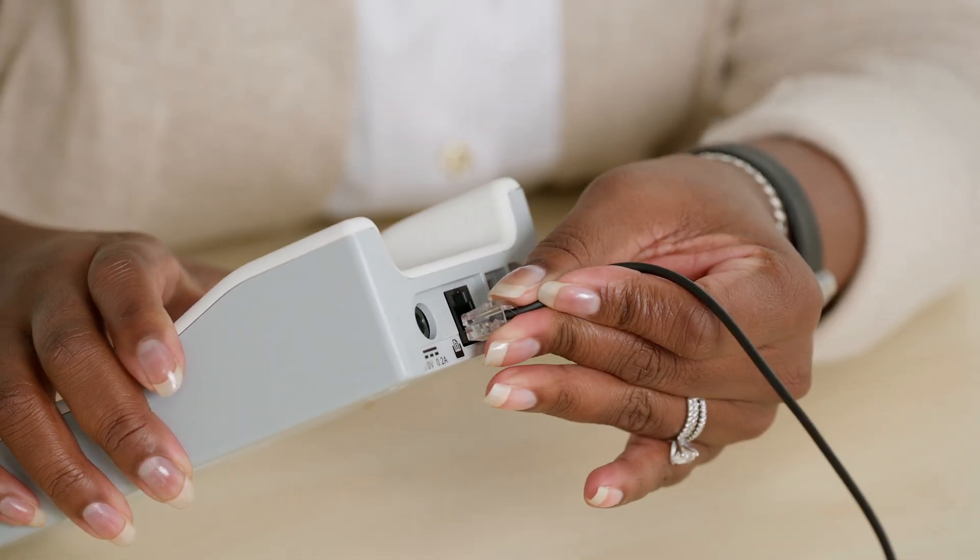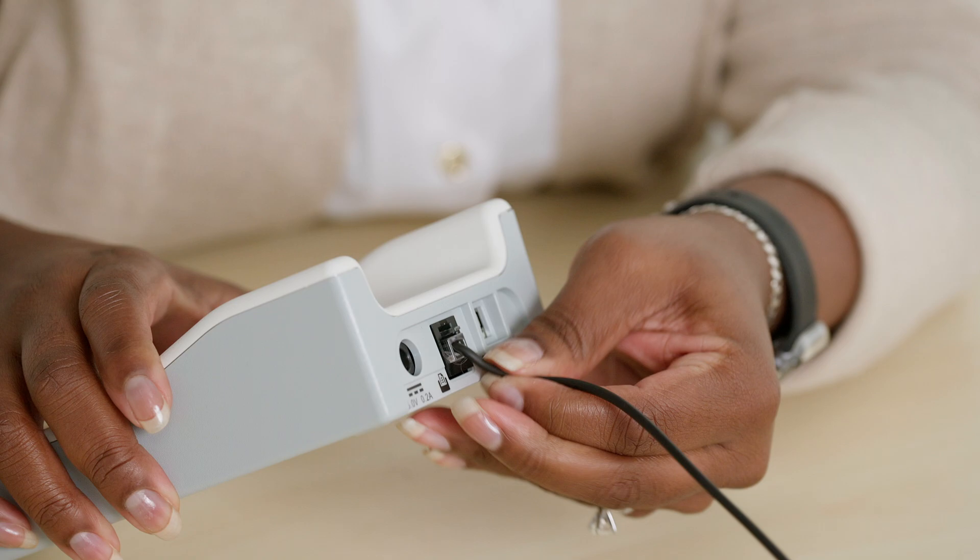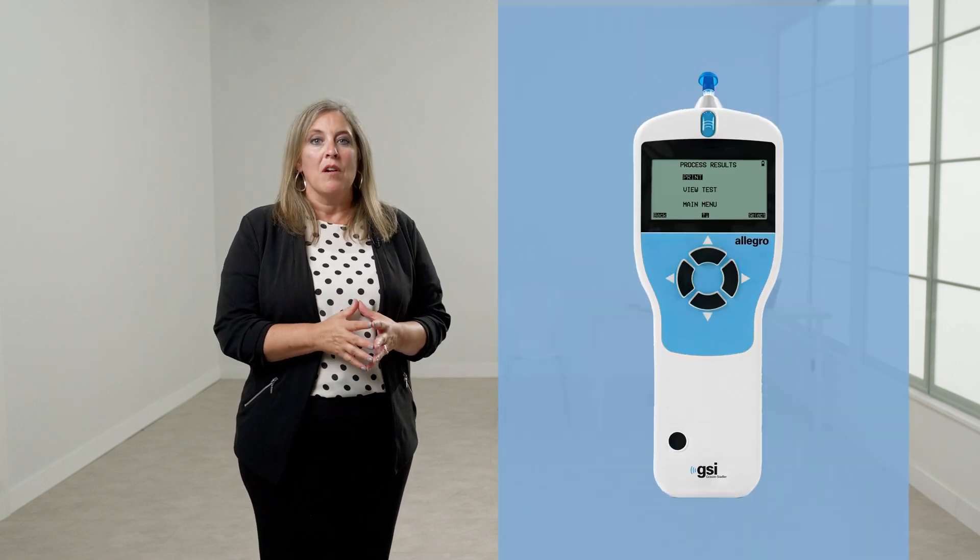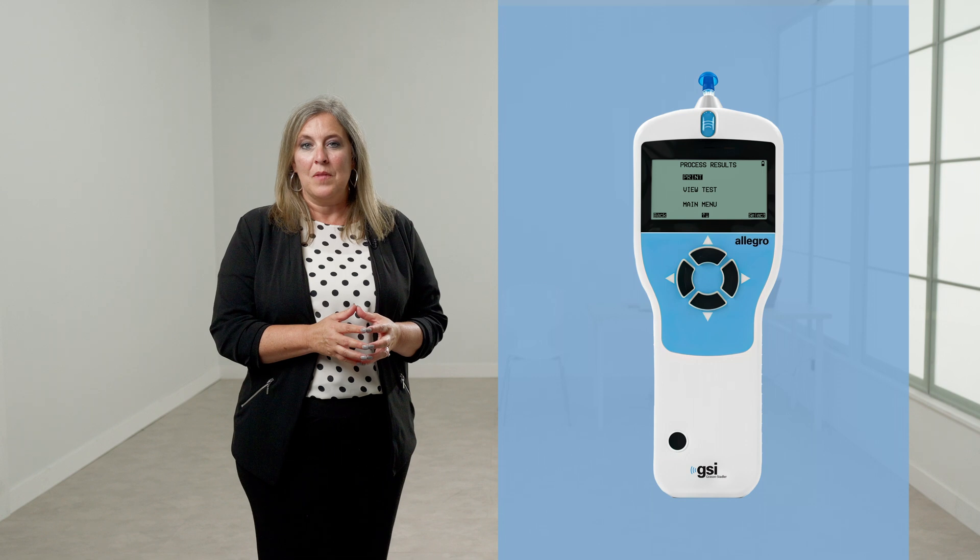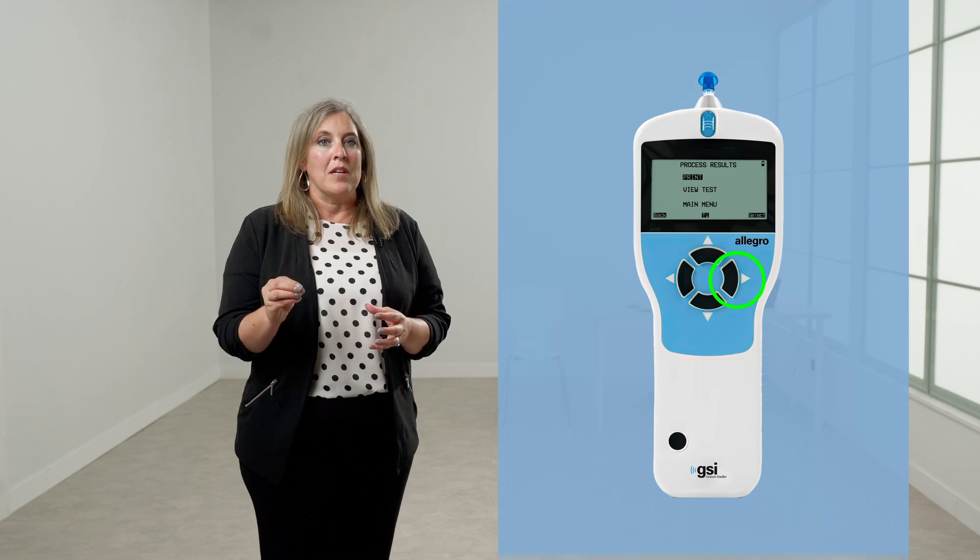Before attempting to print, ensure that the printer is fully charged, switched on, loaded with paper, and physically connected to the cradle with the printer serial cable. Place the Allegro into the cradle when you are ready to print. To print results of the last test performed, select Send to Printer from the Process Results menu. Press the right button when prompted on the screen.